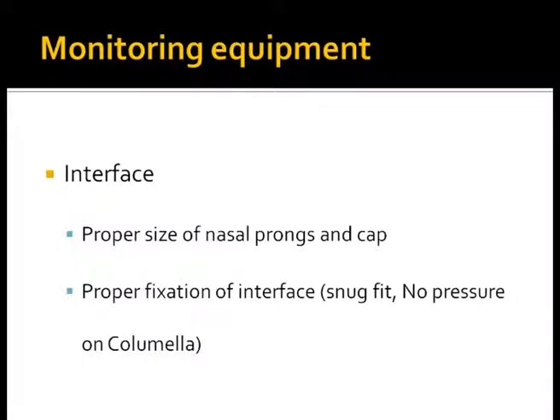Interface should be monitored at regular intervals, particularly to confirm whether they are in place or not. A little distance from the nasal septum is required to prevent nasal septal injury. Interface should be snugly fitted. There should not be any pressure on the columella.